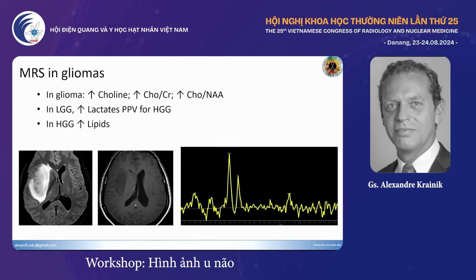When you start to have a higher grade, you will start to see more lactate, but you can also see lactate in lower grade, and especially lipids, especially when you have high-grade gliomas.